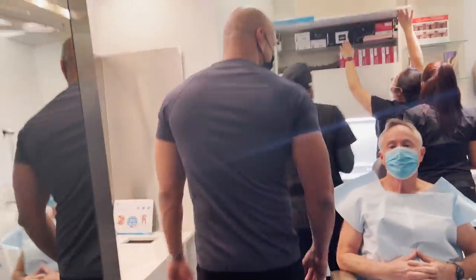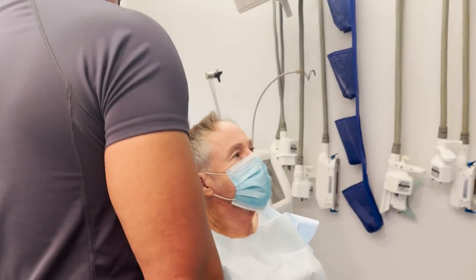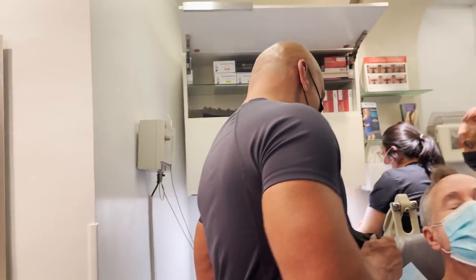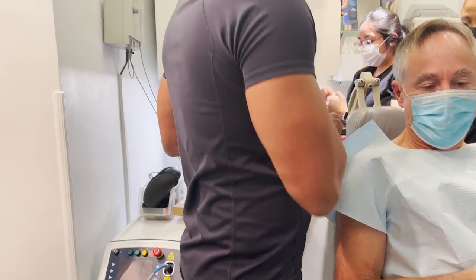How are you doing? Alright, so the worst part of this is the local anesthesia medicine. It's like a pinch and a burn. That's all you're going to feel. Make an incision, get that cyst out, put some stitches in.